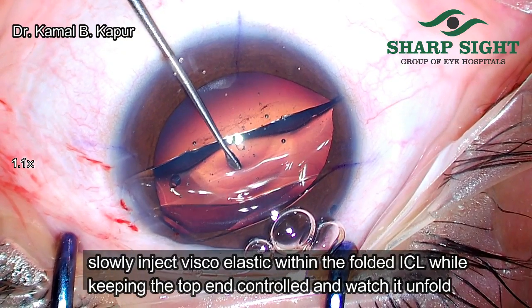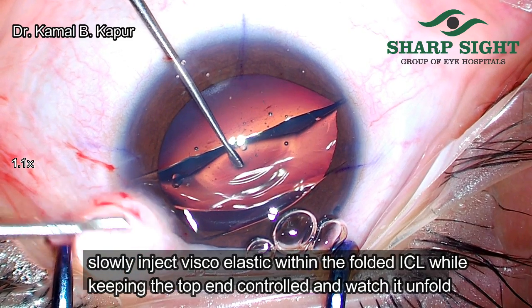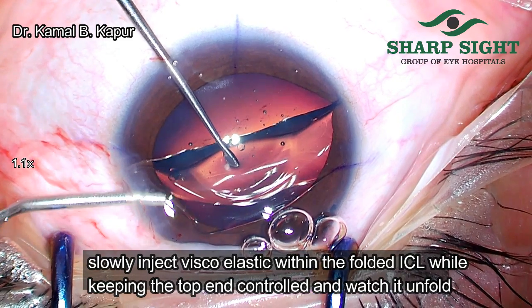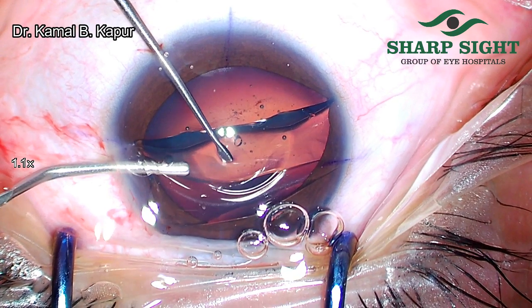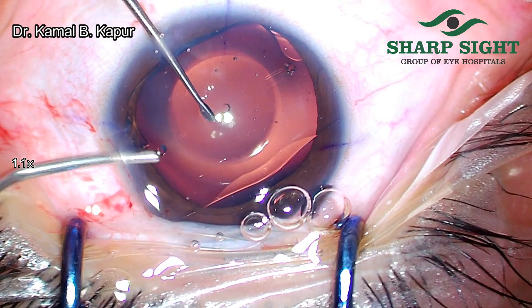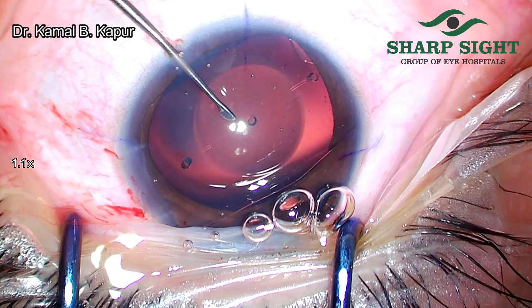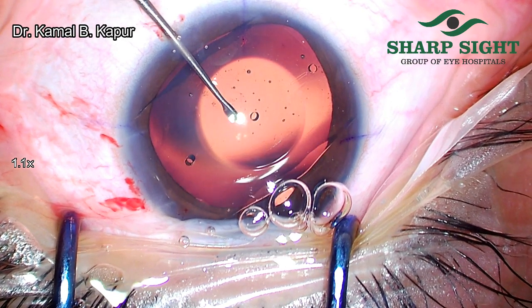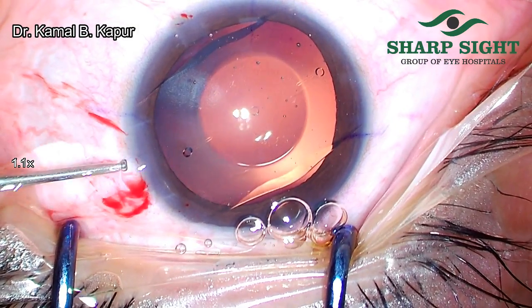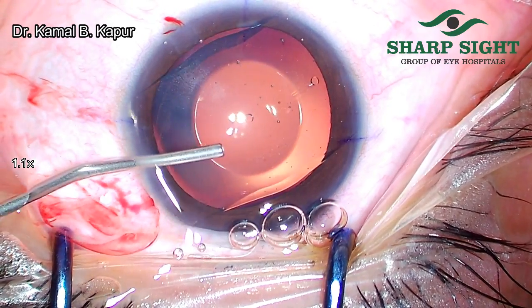In slow motion, we will notice that while the left hand stabilizes the ICL from opening completely and upside down, the right hand slowly goes and injects viscoelastic within the unfolded ICL. And slowly, gradually, softly opens the lens in the right direction, thus ensuring that the endothelium of the cornea is not rubbed, and also avoids the second procedure of explanting the ICL and putting it back inside the eye.